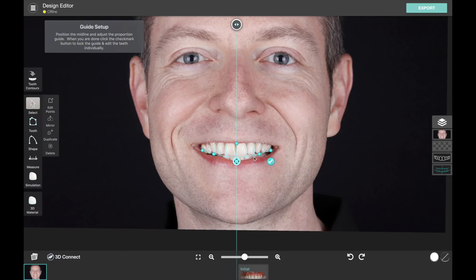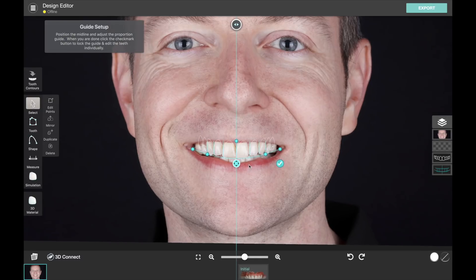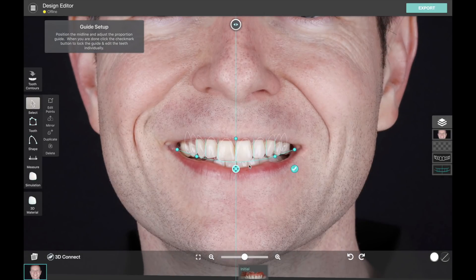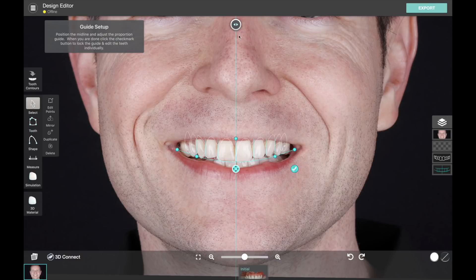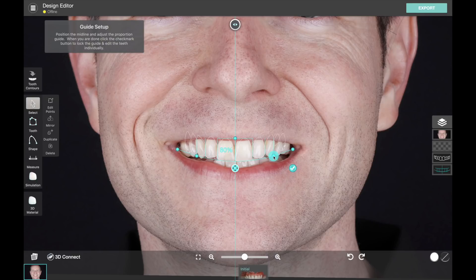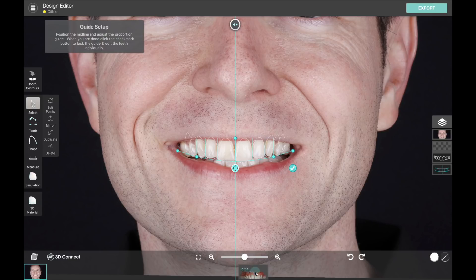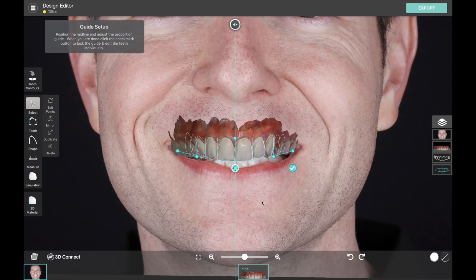So the idea of our intraoral scan support is that it gives you a retracted view of the teeth without actually having to take a retracted picture. So in many cases, if the patient's smiling and displaying enough of the teeth that you can actually do this, then it's a great way to speed up your workflow.